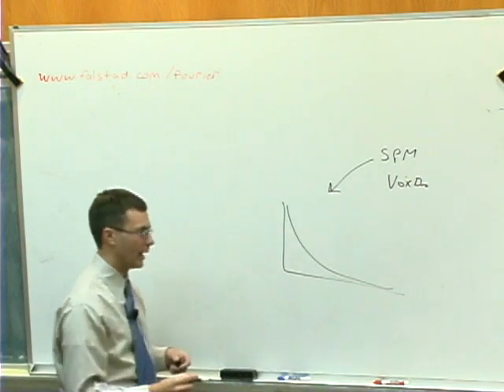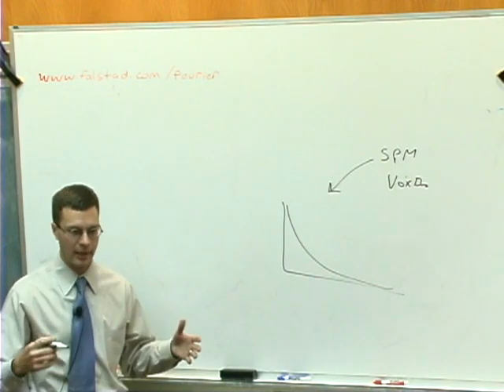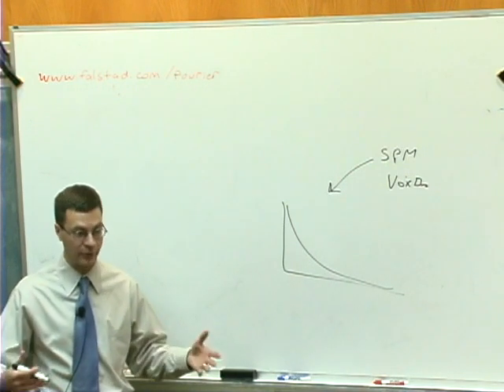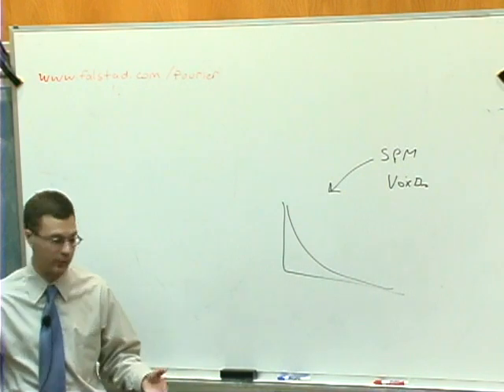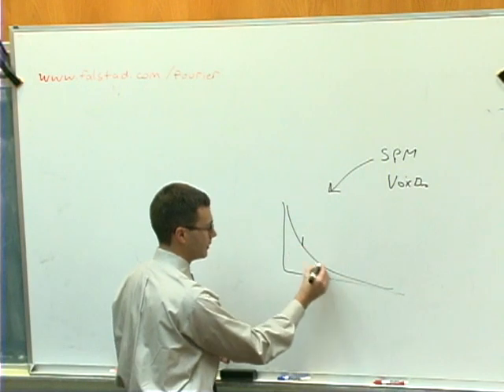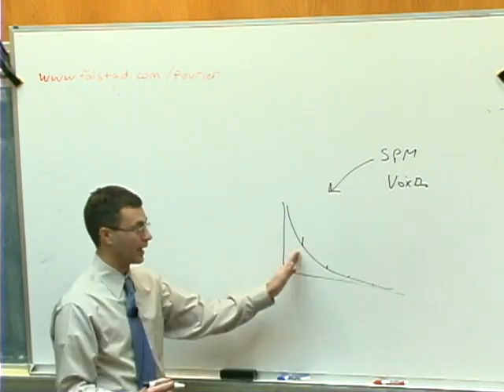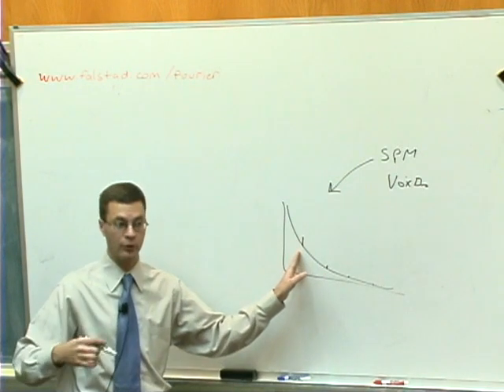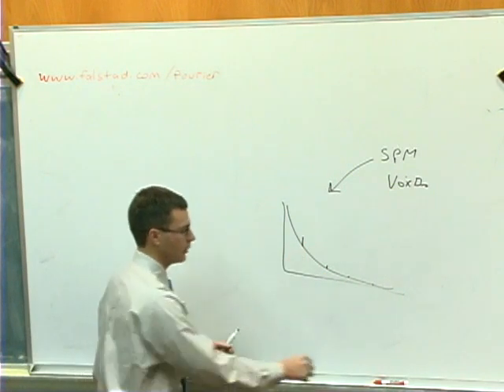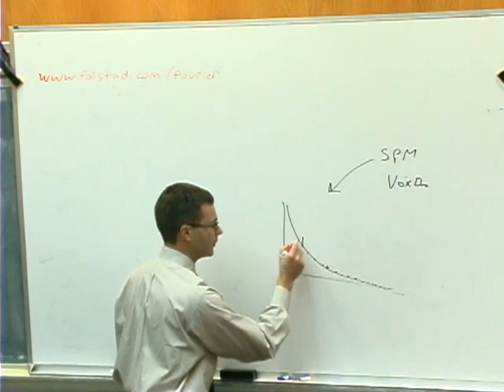The one additional nuance is that, in addition to the noise, if you take the average power spectrum from an experiment in which the subject actually did a task, so suppose every 30 seconds you flash lights and 30 seconds was dark, 30 seconds you flash light, 30 seconds was dark, you might see this noise power spectrum, but then superimposed on it a little blip here. So what would that be? Well, that's your experimental effect superimposed on top of the noise spectrum that was there to begin with, right? You imagine that to begin with, if you hadn't presented your stimuli, there was going to be a noise spectrum that looked like this.